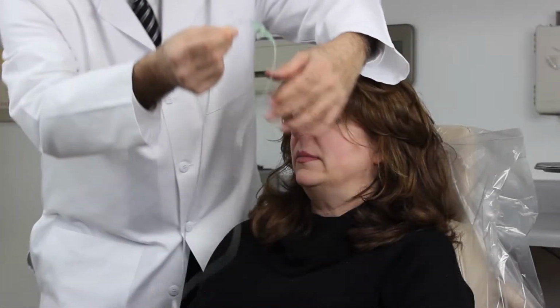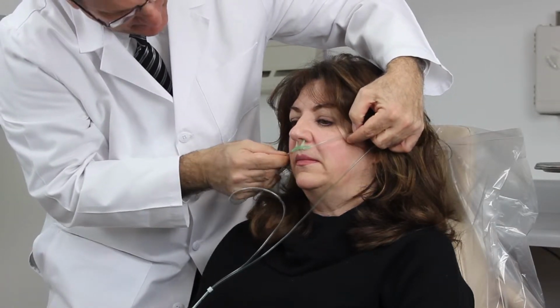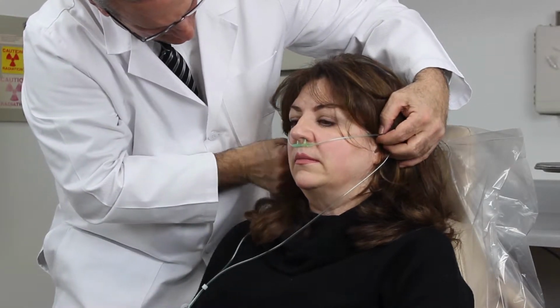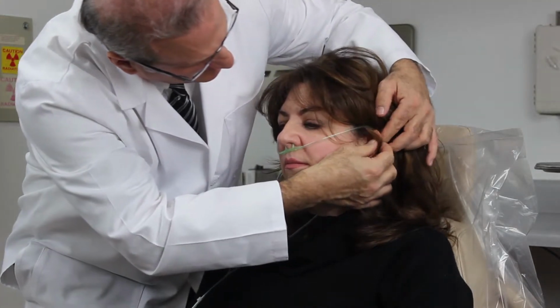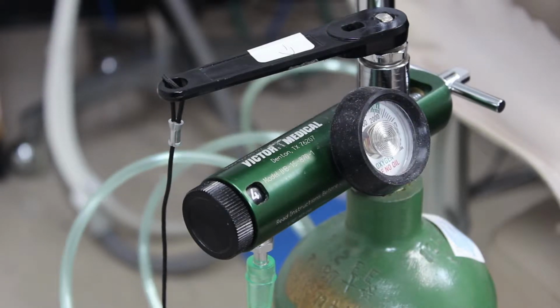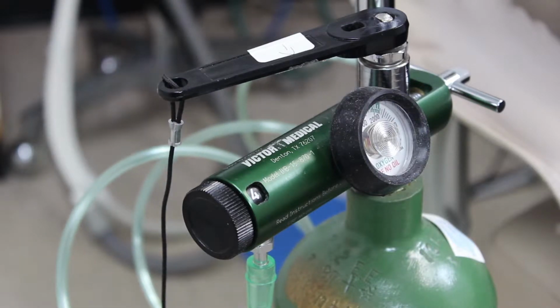Our first demonstration shows the proper placing of a nasal cannula on a patient's face. Place the cannulas in the patient's nose and leave the adjustment near the crown of the head. Leaving the adjustment high will allow it to stay on much better. Using a nasal cannula is good for minor distress situations. We usually run it at about 4 liters per minute. At 4 liters per minute, we increase the oxygen delivery to approximately 36%, compared to the 20% of room air. Running it at too high a flow rate can often be uncomfortable for the patient.